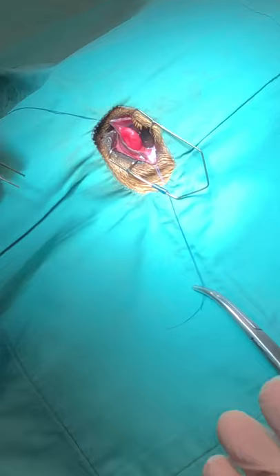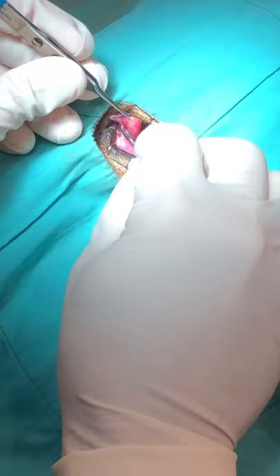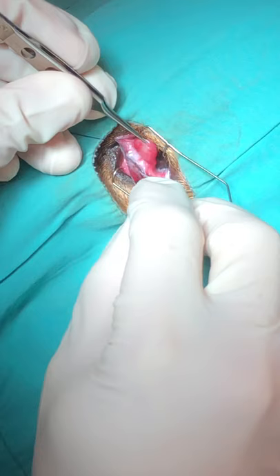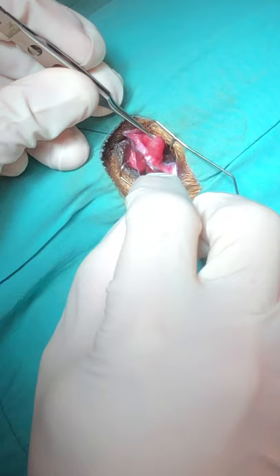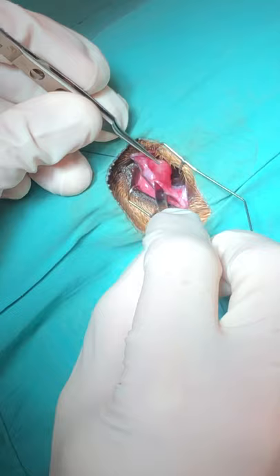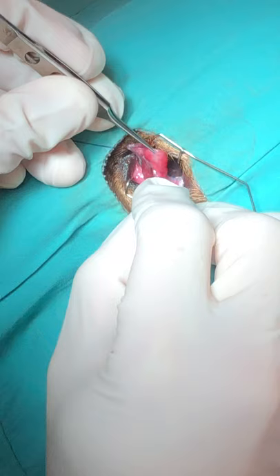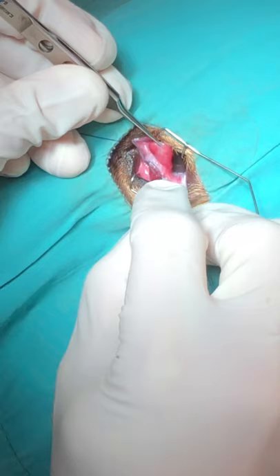The first thing we're going to do is take a 15 blade, or even a small beaver blade if you have it, and make an incision right along the base of the gland. It's going to be a very superficial incision. If you can avoid going deep enough to incise all of the blood vessels around there, that's really helpful for blood flow to the gland. Some vessels will get cut and there will be a little bleeding, but you're basically just trying to create this pocket. Make the incision at the base here with really light pressure and you can start to see the tissue separate.